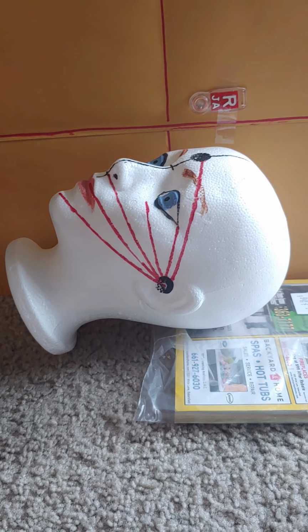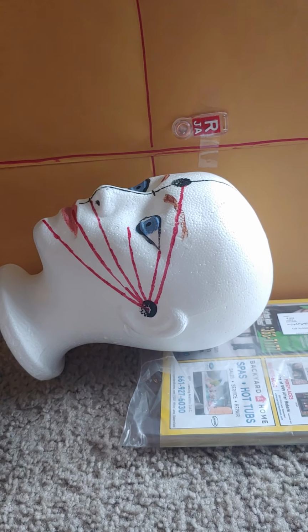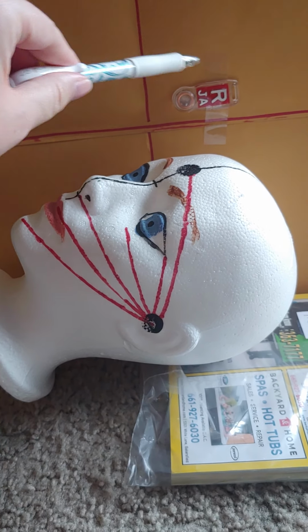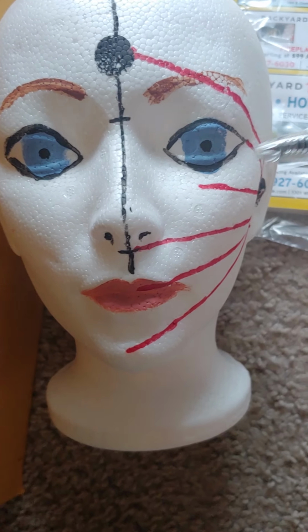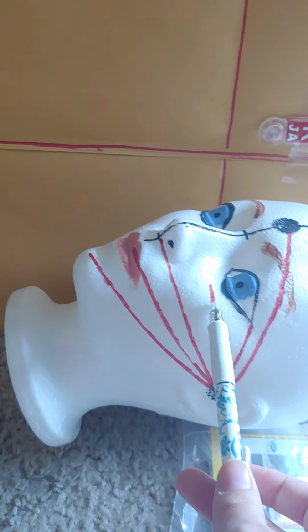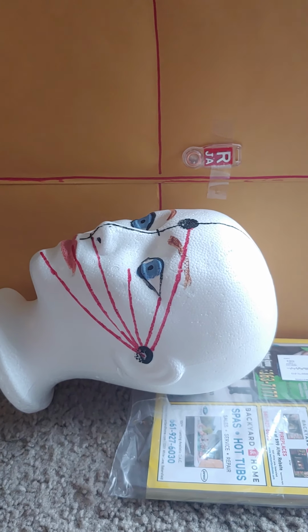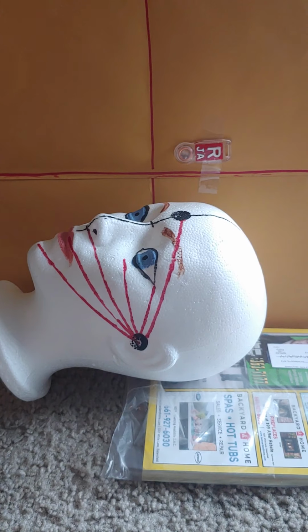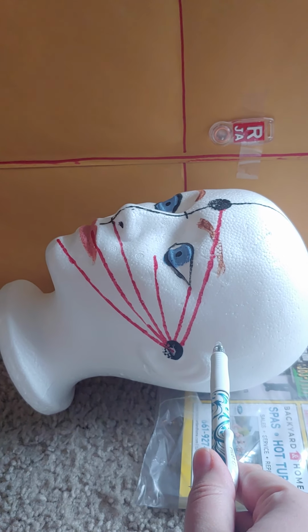This is my cross table lateral skull. So the MSP is parallel to the IR. The interpupillary line, so here, is perpendicular to the IR. And the IOML is perpendicular to the front edge of the IR. There is no angle on here. The central ray is perpendicular, and the entrance point is 2 inches superior to the EAM.